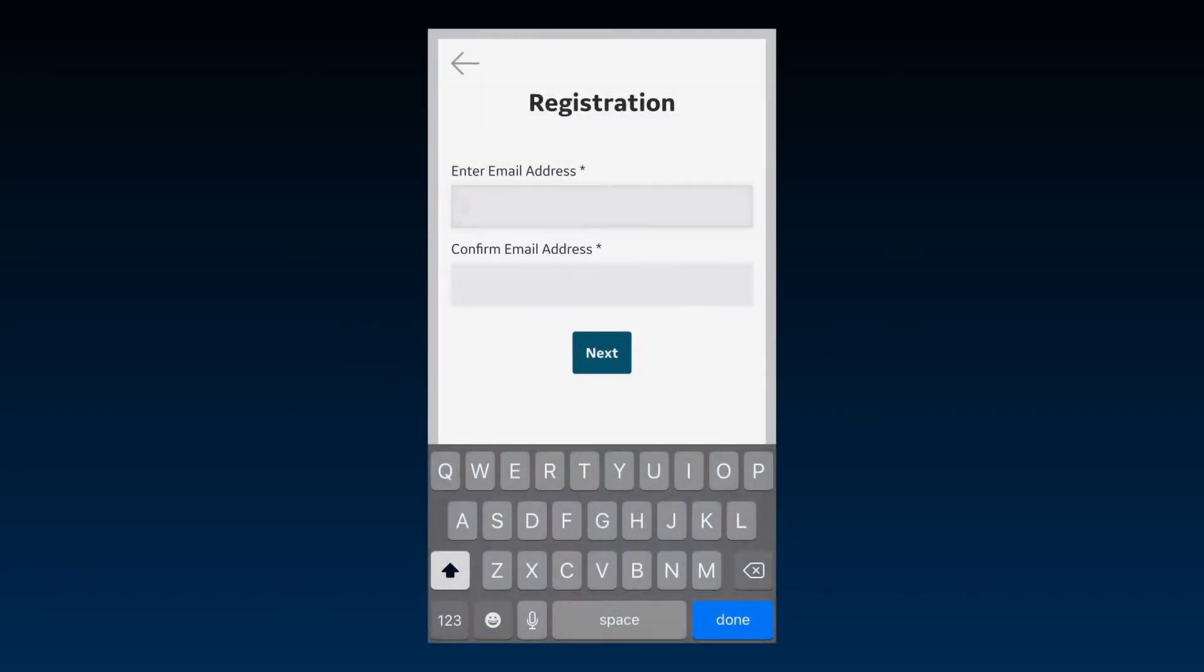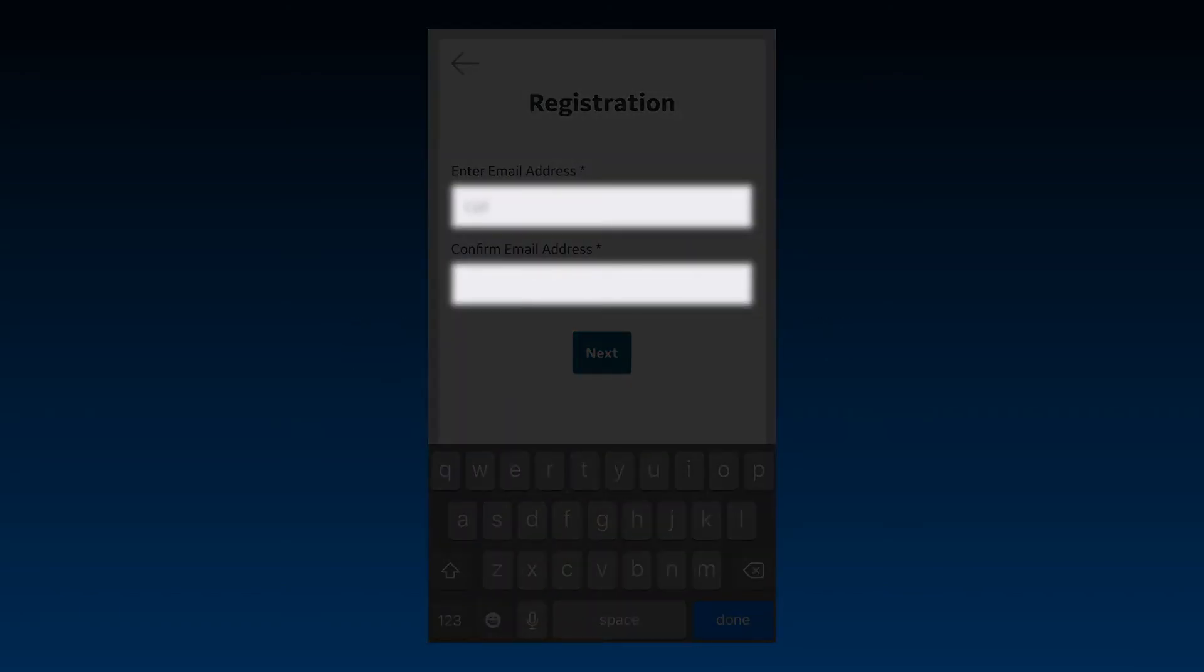Note, you can also create an account through the vScan handheld ultrasound web portal. Enter your email address and create a password.